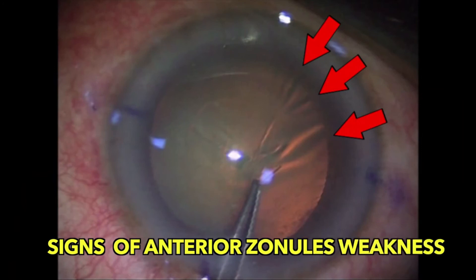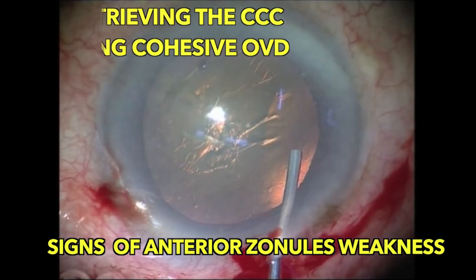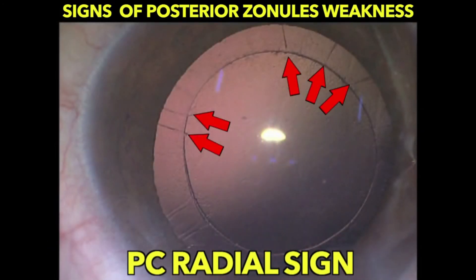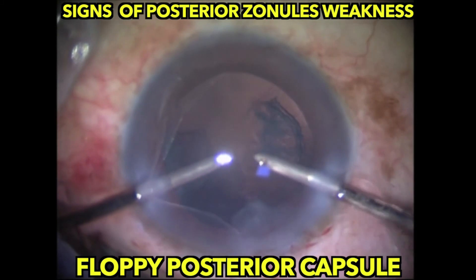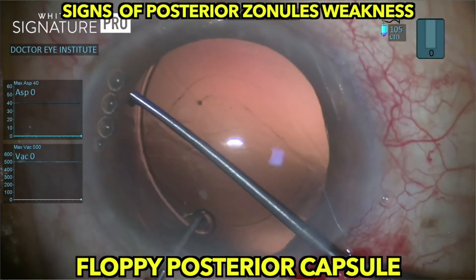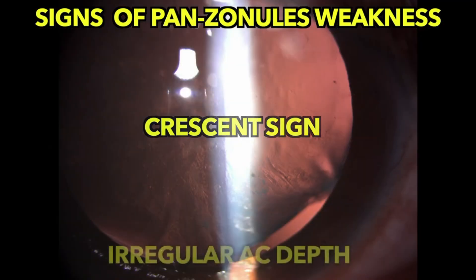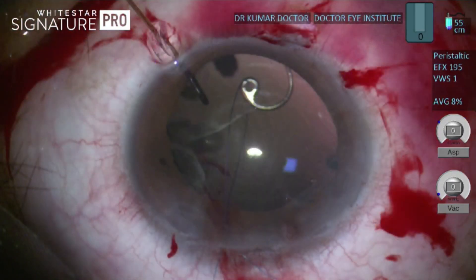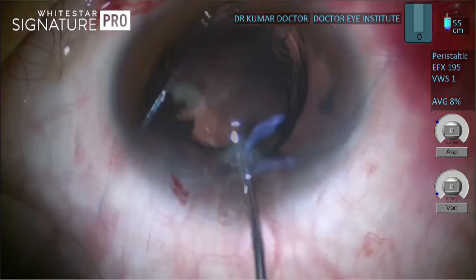To summarize: the presence of capsular wrinkles while performing capsulorhexis is a sign of selective anterior zonular weakness. Use of a cohesive viscoelastic prevents rexis runoff in such cases. The novel PC radial sign and floppiness of the posterior capsule causing it to follow the aspiration probe during cortex removal are signs of selective posterior zonular weakness. This floppy posterior capsule should always be stabilized with an endocapsular ring. Iridofacodonesis, a crescent sign, and irregular anterior chamber depth are signs of panzonular weakness. Capsular hooks, Cionni ring, and endocapsular segment should be used to perform safe in-the-bag phacoemulsification followed by IOL implantation in such cases.